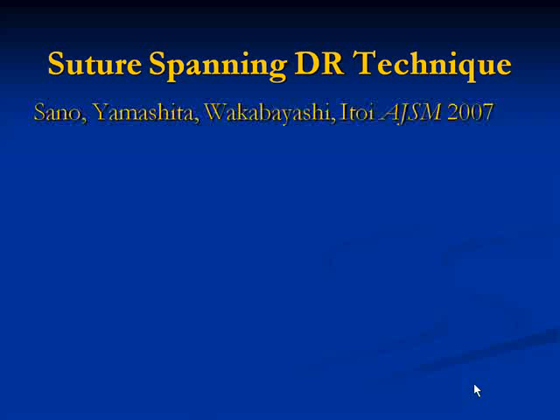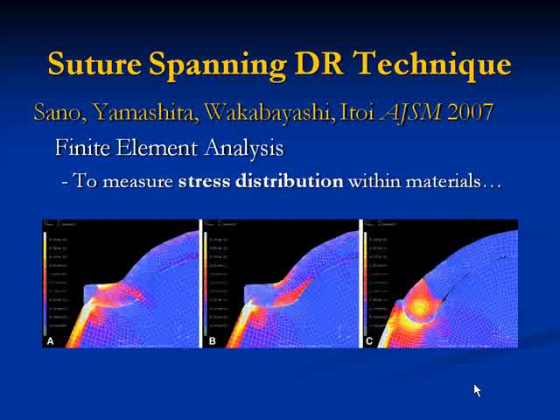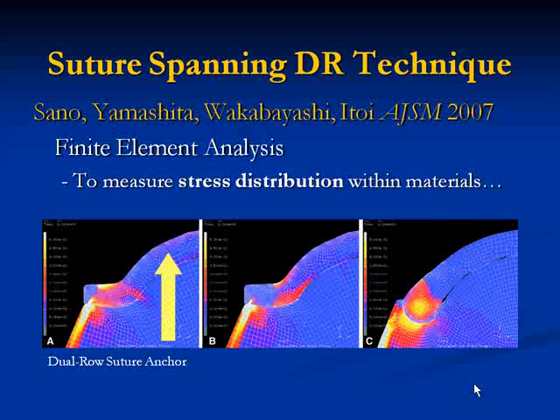Dr. Sano and Itoi from Japan had a study using finite element analysis to measure stress distribution within the tendon. And they found that double row and single row anchor repairs, essentially suture anchor repairs, concentrated the stress in the tendon at fairly high levels, whereas a transosseous suture repair tended to distribute that force more evenly across the tendon.